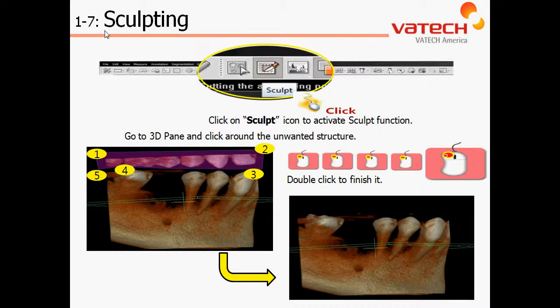Chapter 1, Section 7: Sculpting. The Sculpting Utility will allow us to remove anatomy from our data. The icon is located at the top of the window, which resembles a scalpel.